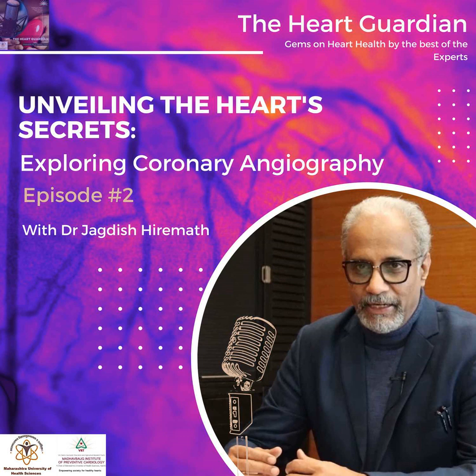But X-rays cannot detect blood unless the blood is made radio-opaque. A long tube, or a catheter, for this is passed up the arterial tree to reach the base of the aorta.